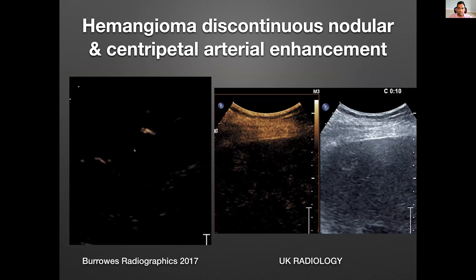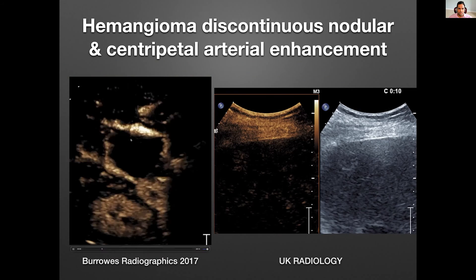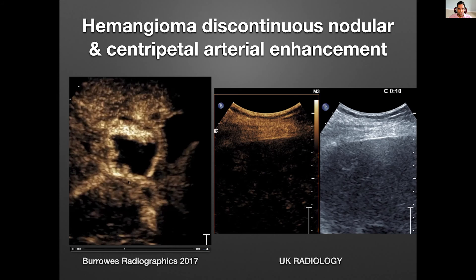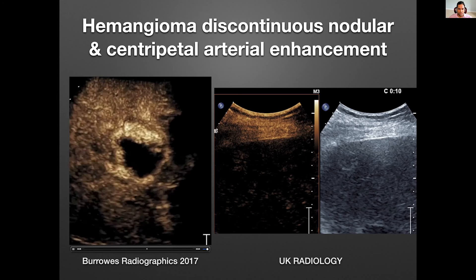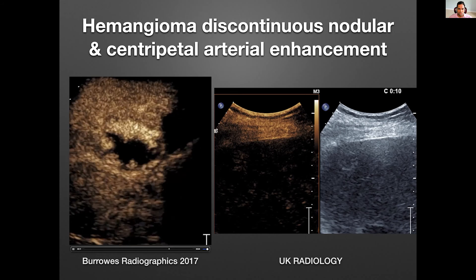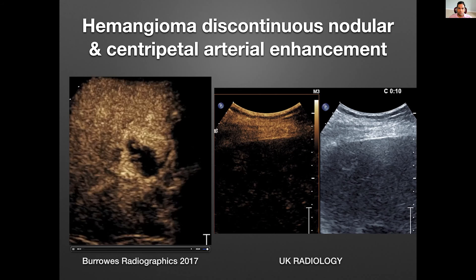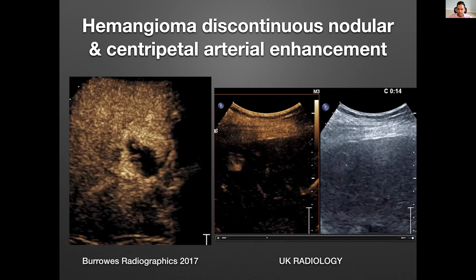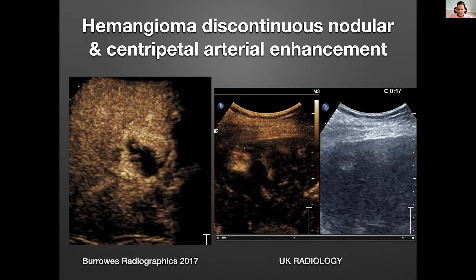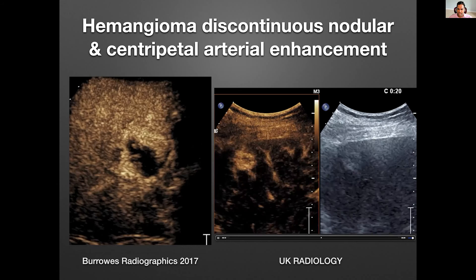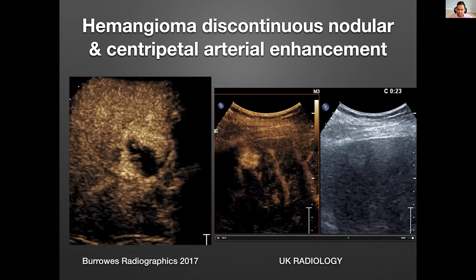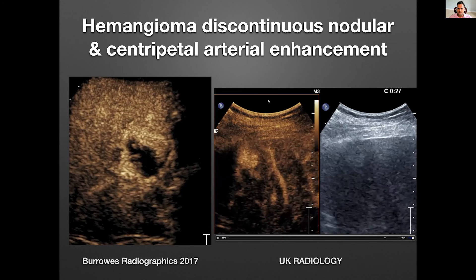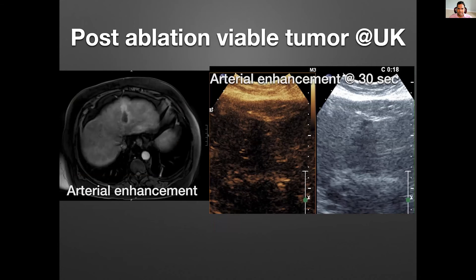Now showing a hemangioma pattern — discontinuous nodular arterial enhancement from the literature, suggestive of a hemangioma. At four minutes this continues to enhance, confirming it as a benign lesion. And an example from our university: the lesion is very faint on grayscale — this was the cover image from the title slide — but after microbubbles you can see very avidly discontinuous nodular enhancement on arterial phase imaging with microbubbles visible throughout the vessels. Again, it had sustained enhancement on delayed phase.